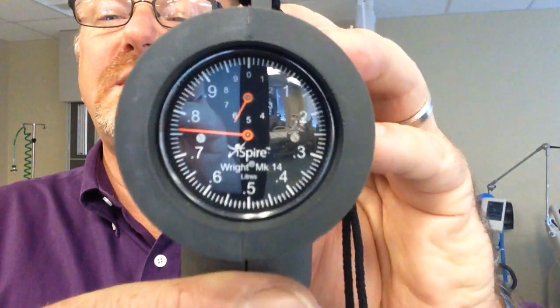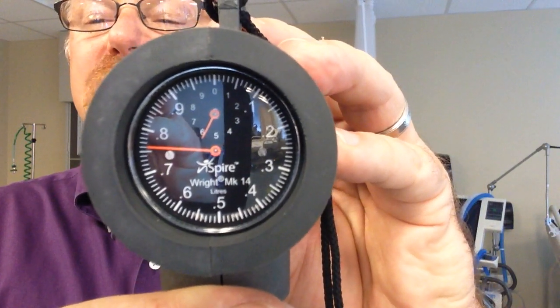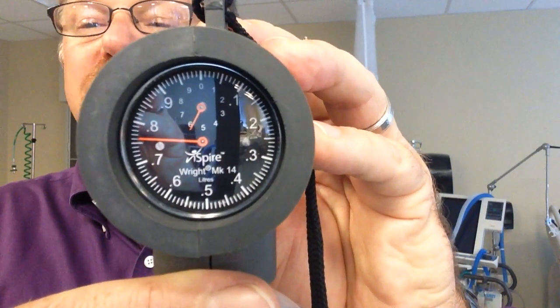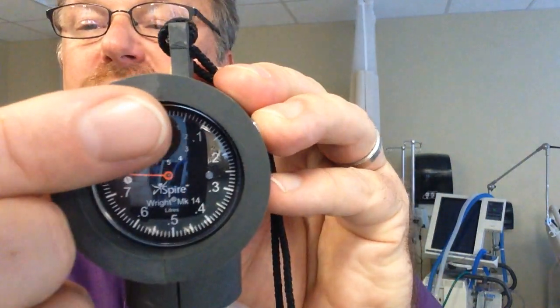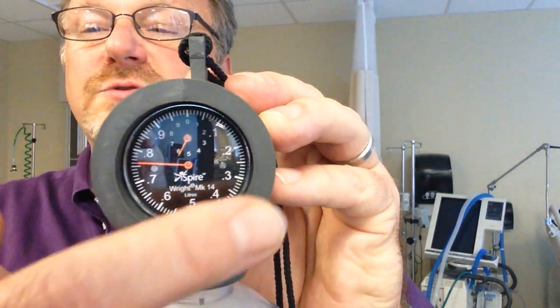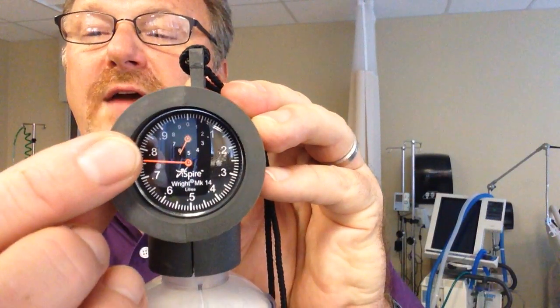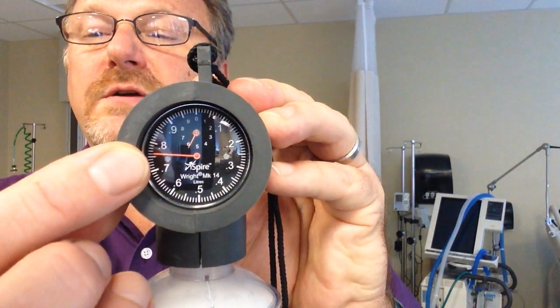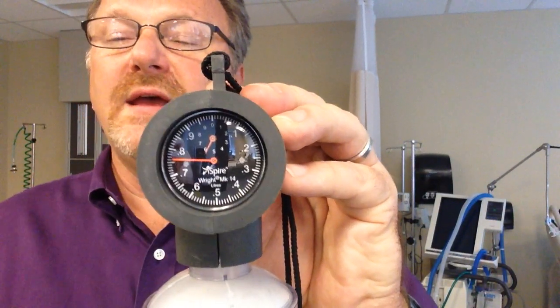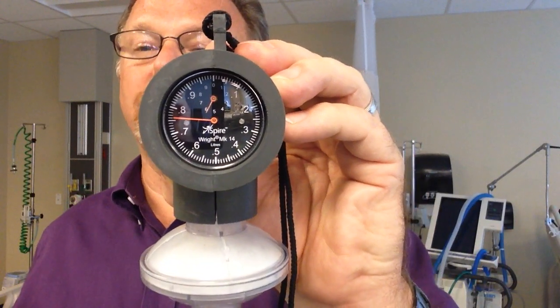As you can see, that is 5 liters 760 cc's, or 5.76 liters. Remember, the small numbers up here are liters. Every time the big needle goes around one time, this will move to a 1. Every little mark on here is 10 cc's, so 0.7 to 0.8 is 100 cc's, or 100 milliliters.